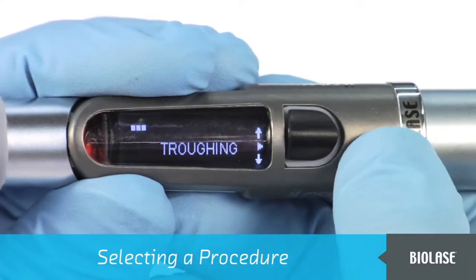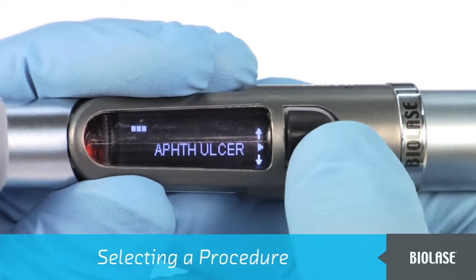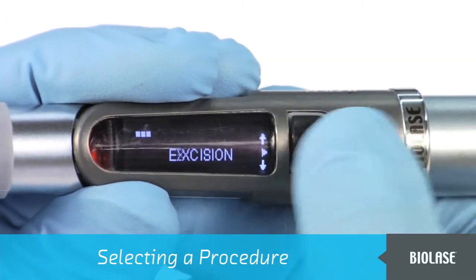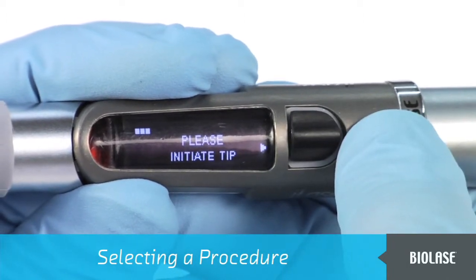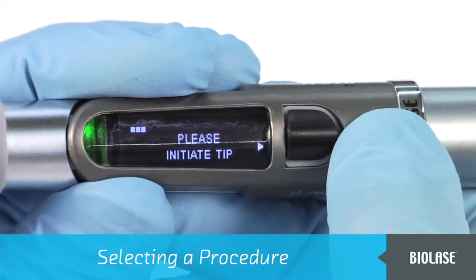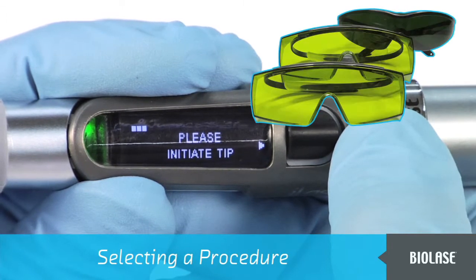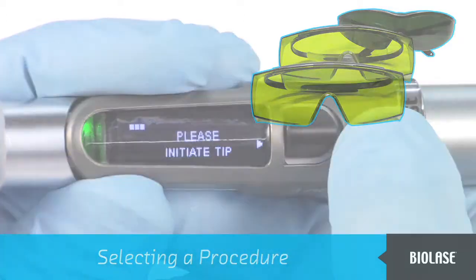The iLase has 10 pre-programmed procedures and 2 extra custom procedures. Scroll through the preset names using the black navigation button, up or down, and then select your choice by pressing in. After selecting a procedure, the LED will turn green and the red aiming beam will come out of the tip. The iLase is now in ready mode, and pressing the finger switch will activate the laser. Please ensure that everyone in the room is wearing the appropriate eye protection.